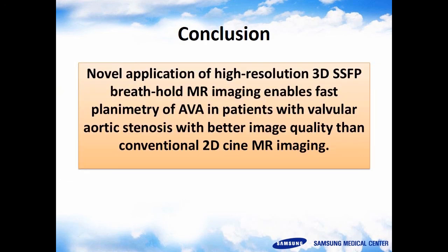In conclusion, high-resolution 3D MR image acquisition with single breath hold SSFP sequences gave AVA measurement with low observer variability that correlated highly with those obtained by echocardiography. We propose that 3DP can be used to assess the severity of AS in clinical practice.